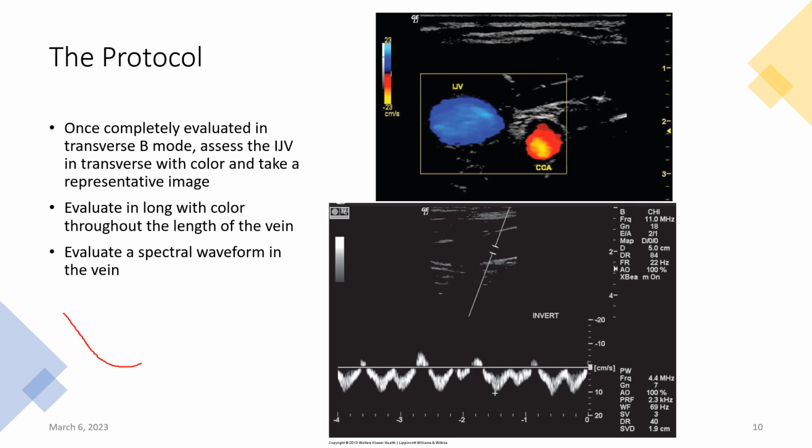We had just that nice phasic flow of the venous blood that matched when my patient's thoracic pressures were changing. But here we're getting that phasic flow caused by the changes in thoracic pressures, but we're also seeing this bit of pulsatility because of recoil from that right heart.